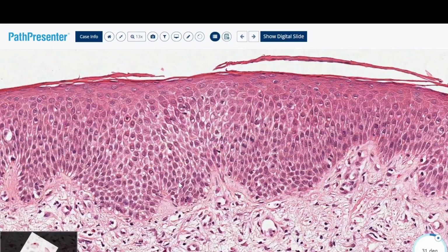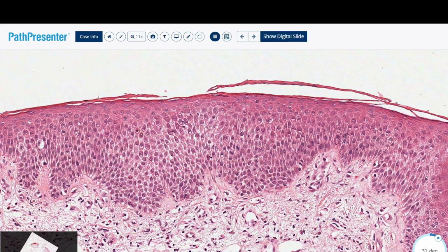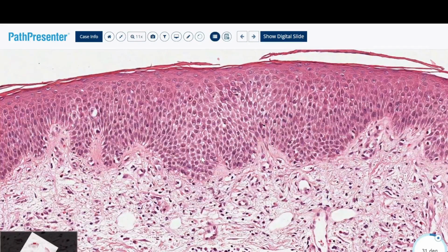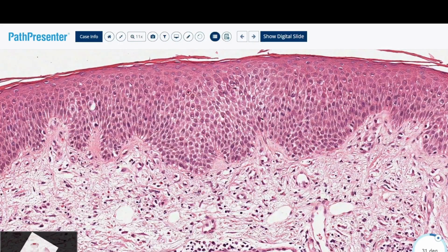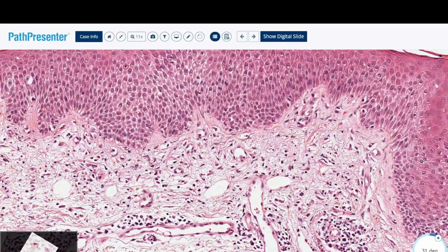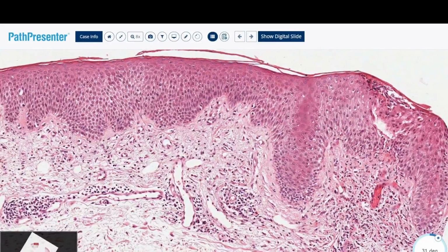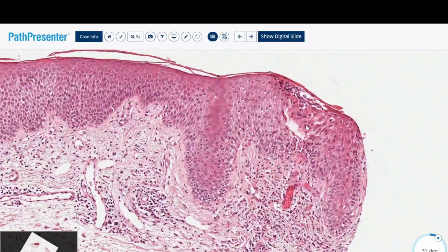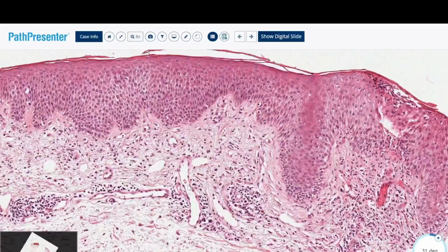So let's talk more about this lesion. Spongiotic changes in the epidermis. We can see extravasated lymphocytes, some black dots around this slide. Then in the dermis, we usually will see eosinophils, lots of eosinophils. And then the perivascular lymphocytic infiltration is non-specific at all, so you can ignore it, because in every dermatitis you will see a certain amount of perivascular lymphocytic infiltration. So we can see a lot of lymphocytes in the epidermis and eosinophils. So this is spongiotic dermatitis.